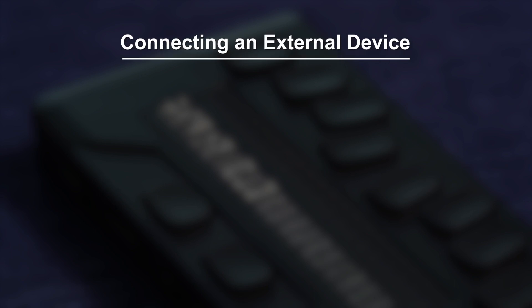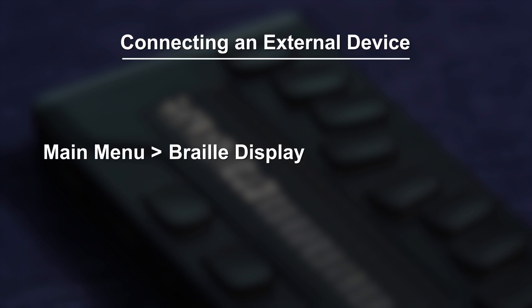To connect to an external device, you will be using the eReader's Braille display mode. From the main menu, select Braille display. Press Enter or a cursor routing button on USB connection, which is the first item on the Braille display menu. The eReader will display: Please wait.